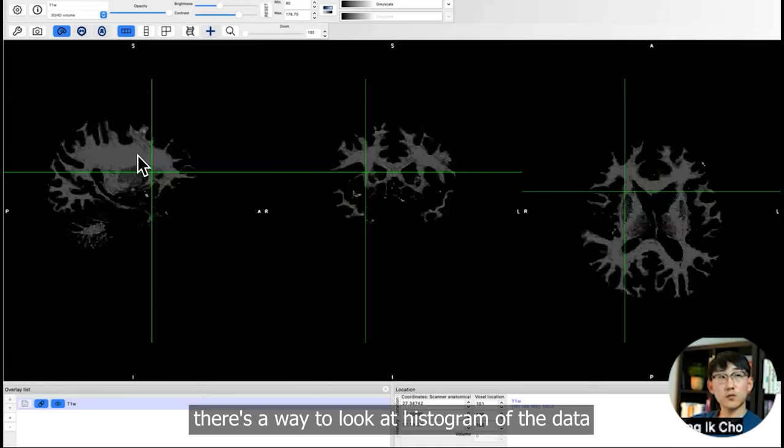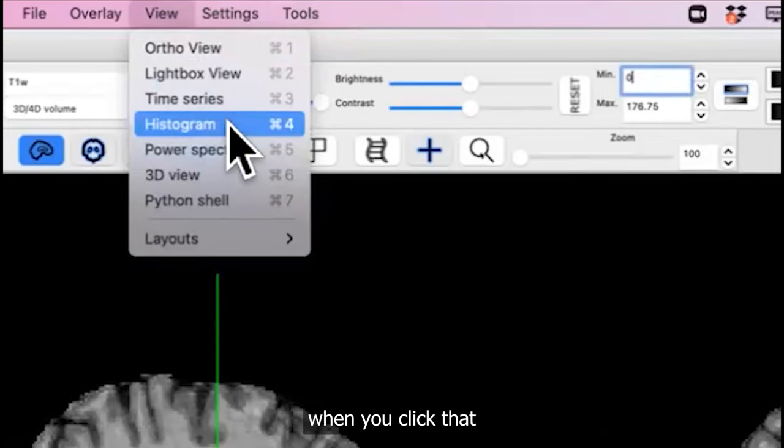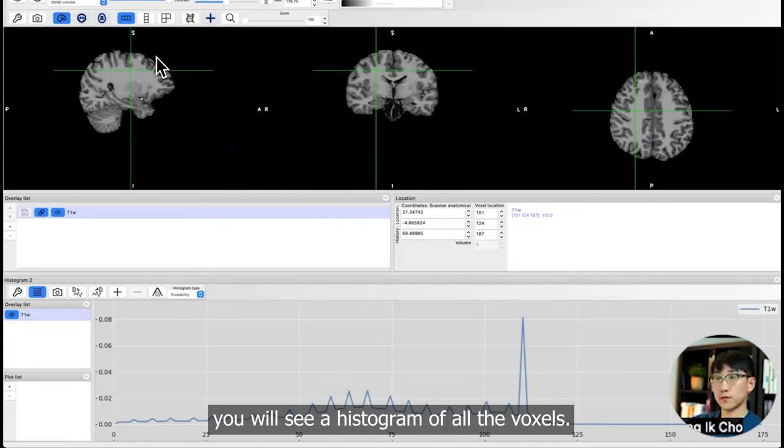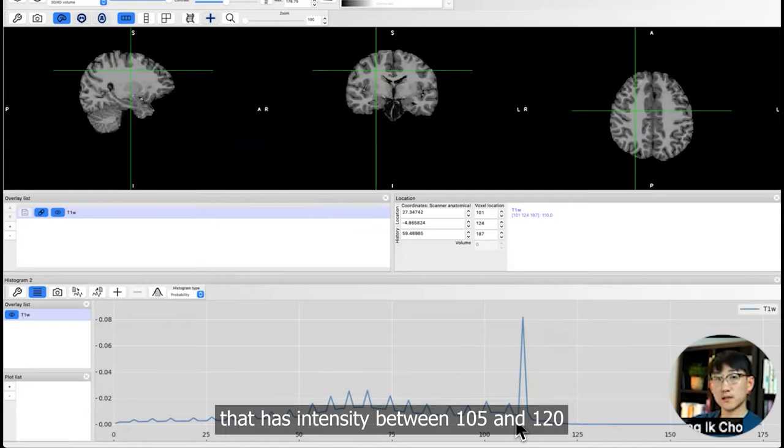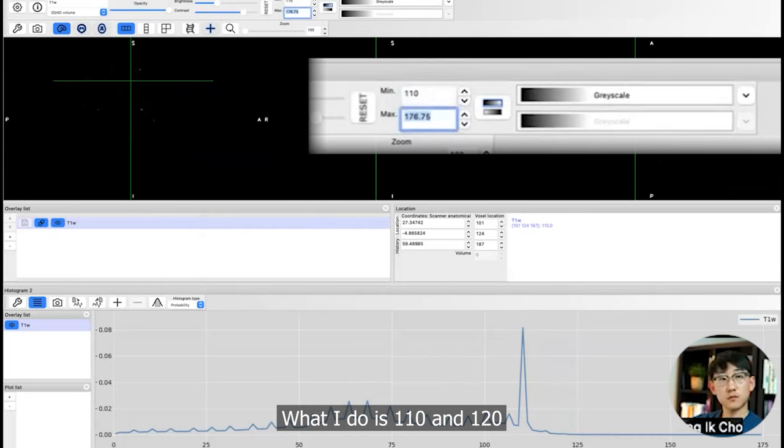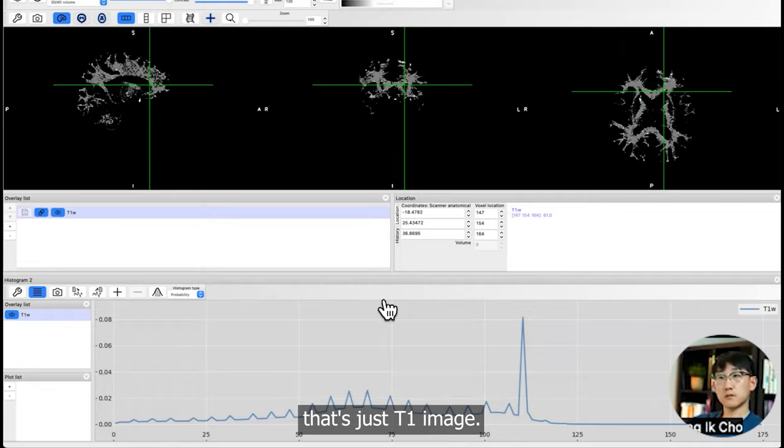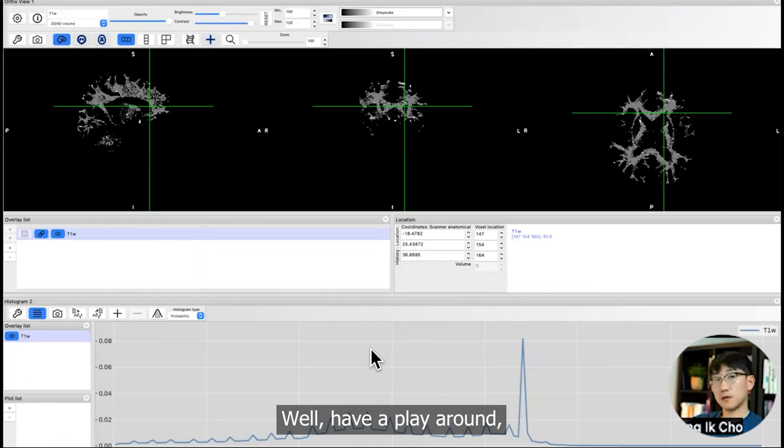There's a way to look at the histogram of the data. Go to View and click on Histogram. When you click that, you'll see a histogram of all the voxels. What it means is that there are many voxels that have intensity between 105 and 120. I wonder what that is. What I do is 110 to 120, set it as 100. There are many voxels which is represented here. So white matter. That's just T1. I'm happy if you got the concept that neural image data is an array.